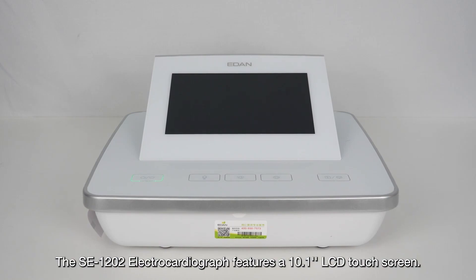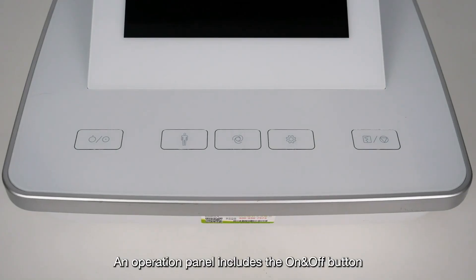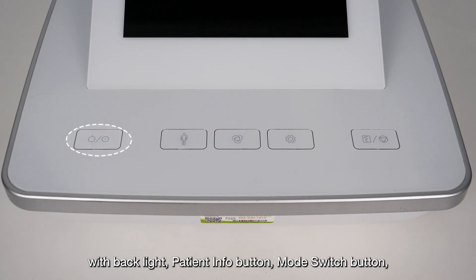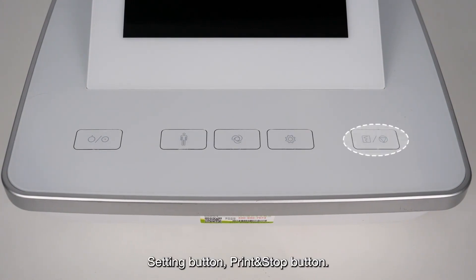The SE-1202 electrocardiograph features a 10.1-inch LCD touchscreen. The operation panel includes the on/off button with backlight, patient info button, mode switch button, setting button, and print and stop button.